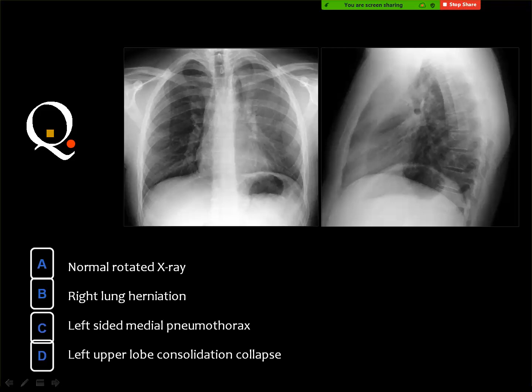Dr. Mamdouh, can I ask about COVID infection superimposed in a patient with trauma? Nowadays, it's problematic, asking whether it is COVID or contusion. You mean a patient with COVID pneumonia who is subjected to trauma? Yes. You want to discriminate between COVID opacities and pulmonary contusion? Yes.